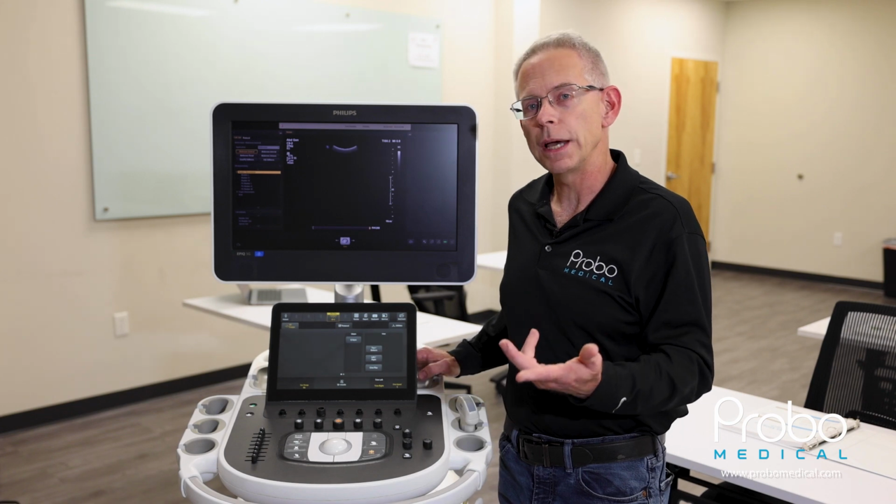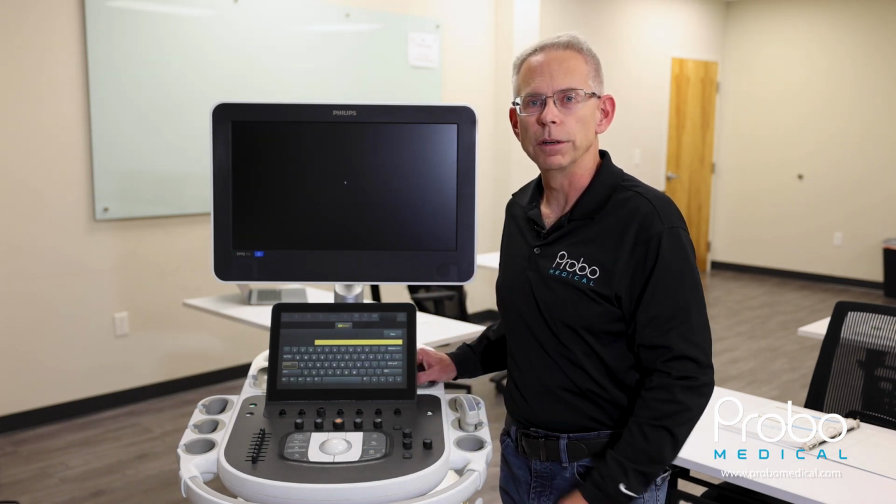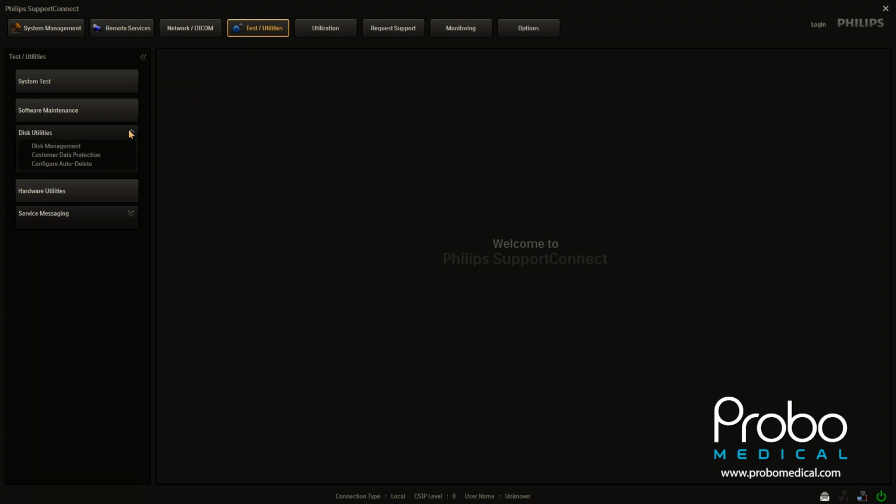As we get ready to do that, you wanna go in and press the support button to enter the support section of the unit. Okay, so once we are in support, we are going to come all the way over to test and utilities, select that. Then you're gonna come down to disk utilities and expand this menu. Now, depending on your software level, this might look a little bit different, but the answers are all still going to be there. So just poke around a little bit and you'll see it.